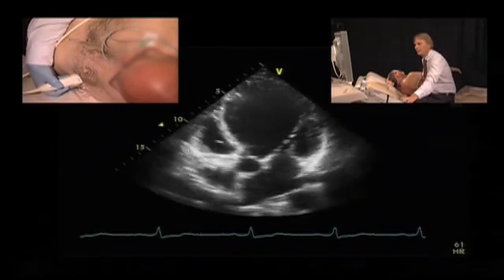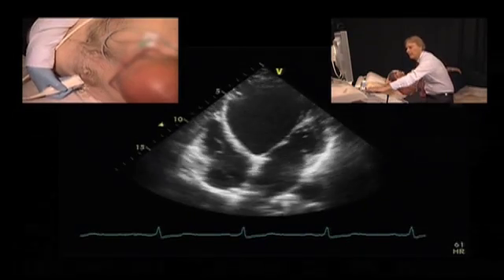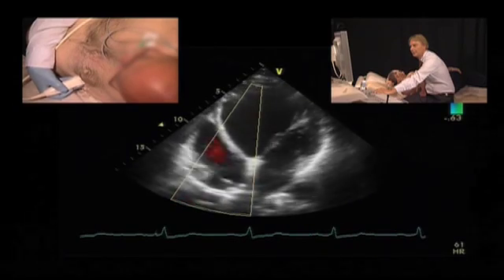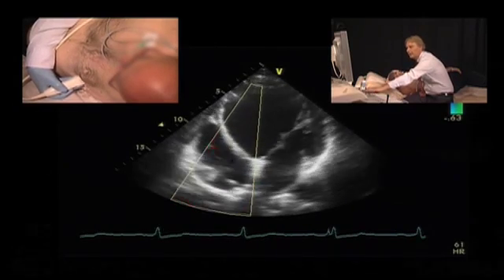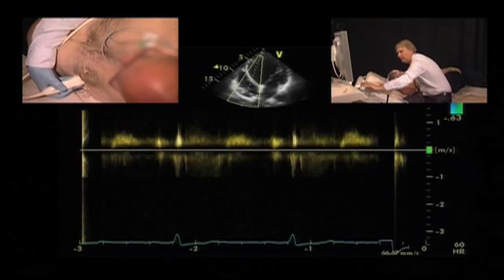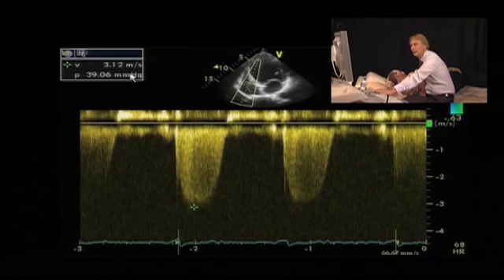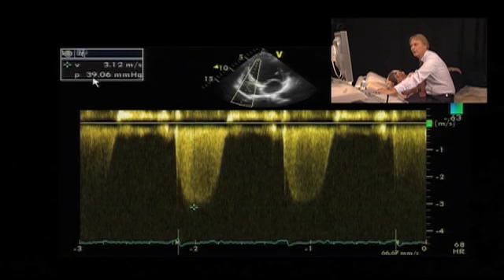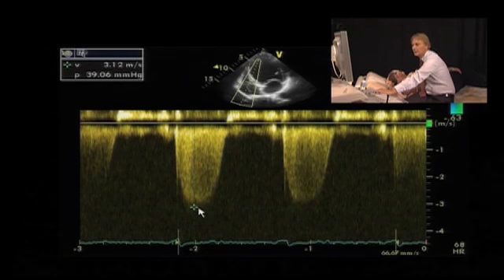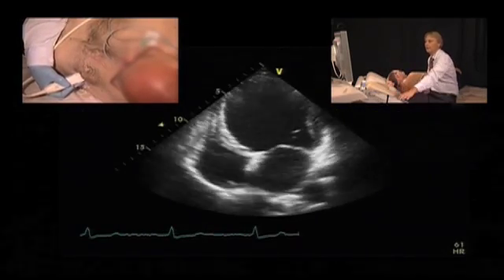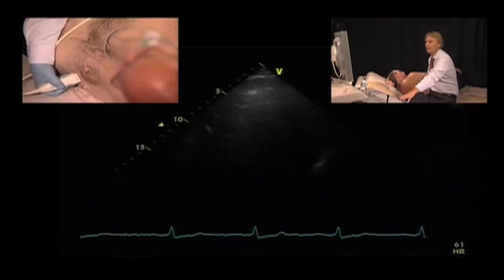Finally, to complete this case, we'll also look at tricuspid regurgitation. There is just mild tricuspid regurgitation here, and let's try to measure the pulmonary pressure. We see that the pulmonary pressure is mildly elevated, but certainly not significantly. Again, this fits very well with our general impression that the patient is well compensated at this time.